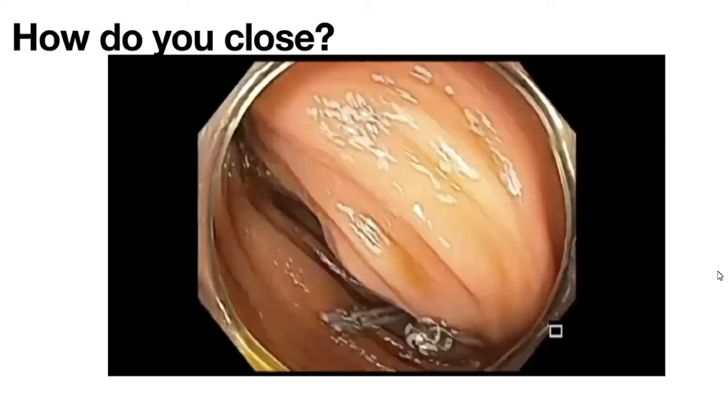And as you go up into the descending colon, about the splenic flexure, flush again, and get into the habit of suctioning whatever you have actually put in. And it does two things. One is it will keep your left colon nice and clean as you come back to examine. But without your knowledge, you will also realize that you are straightening the left colon by doing that maneuver, so that your insertion would be very easy.